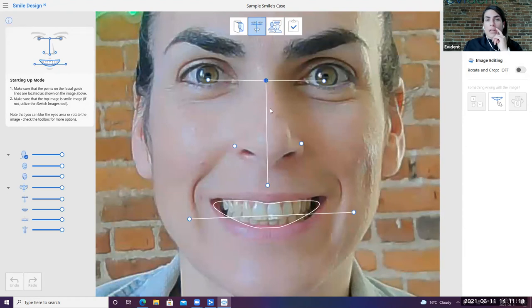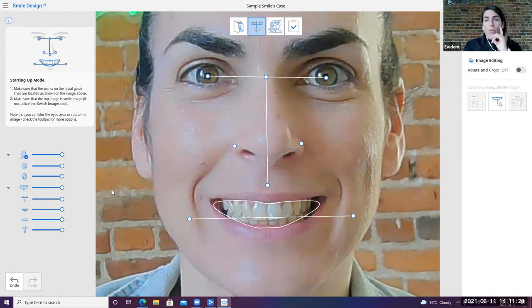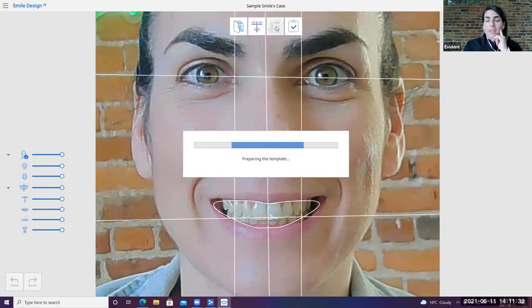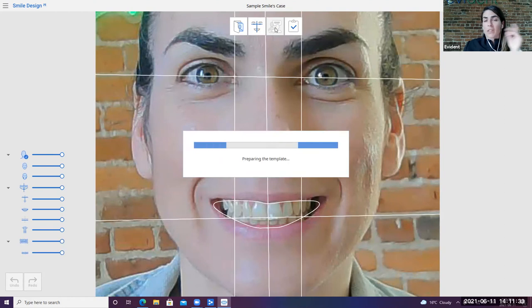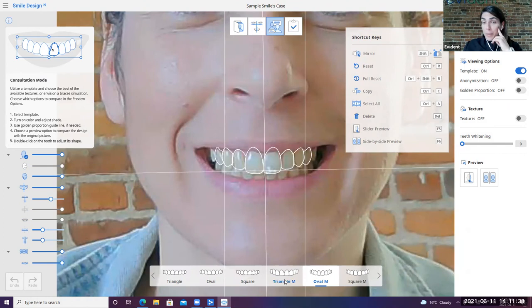So as you can see here, it starts with your marking points and they're all able to be moved just depending on how you want to set them. You say, for example, you'd like to place the pupils in place, all that kind of stuff. That's all ready to go. Once you have your markers in place, you can continue with the template. So this is six pre-organized templates that we have here, to start as a base. So we can say for example, let's start with oval.